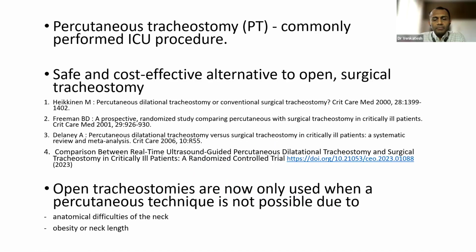In the ICU, it is very easy for us to do it percutaneous rather than the open technique for various reasons. Whether it is planning, the safety, the cost effectiveness, everything when you put together, including the studies, all have shown that it is safe and cost effective to perform percutaneous tracheostomy in the ICU.